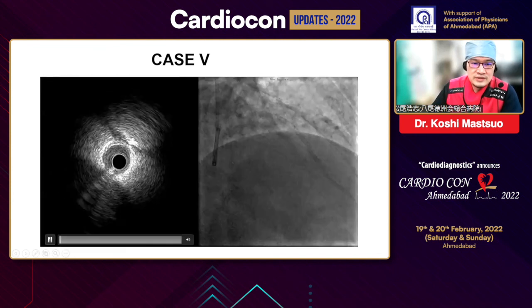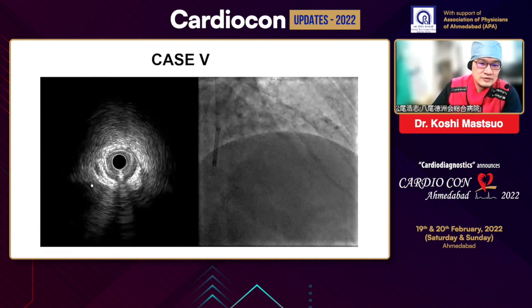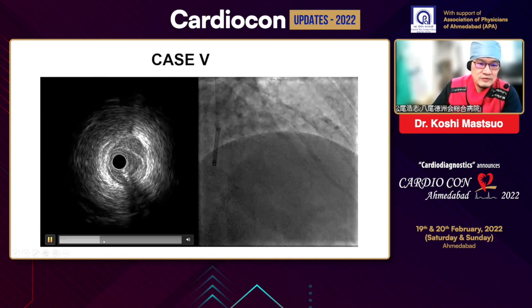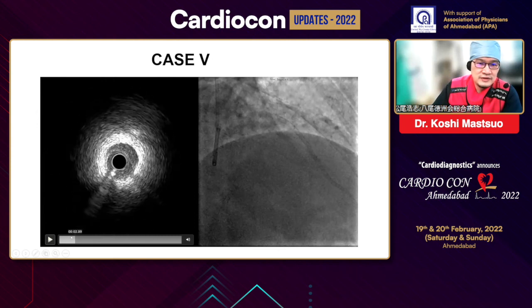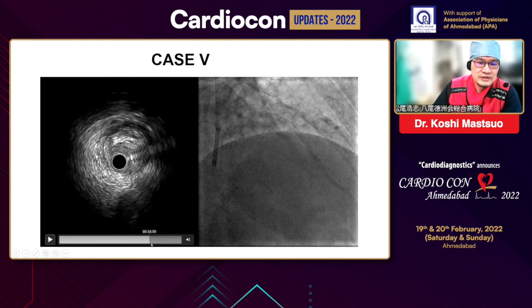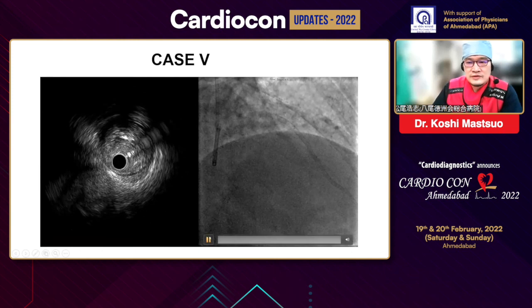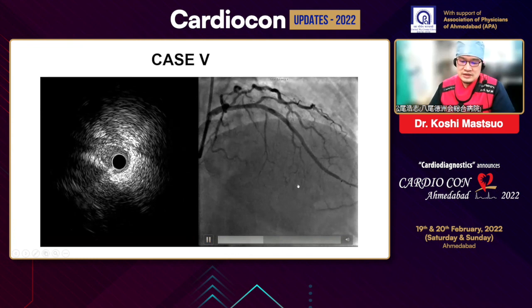This is the IVUS imaging after crossing the true lumen, but you can already see a big subintimal space created here, like this. So finally, I needed long stenting from the distal LAD.